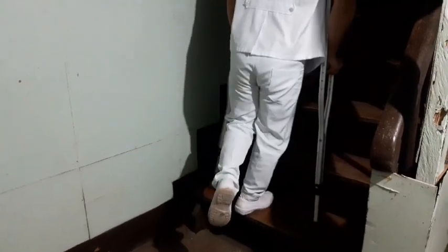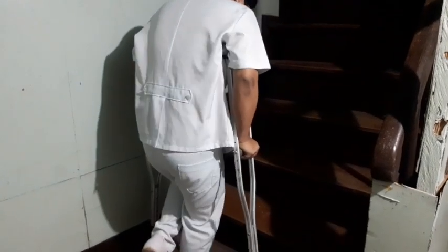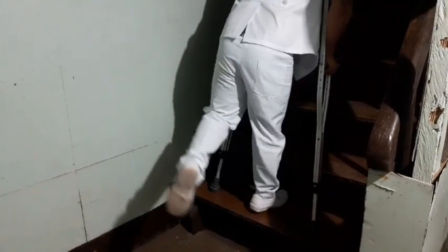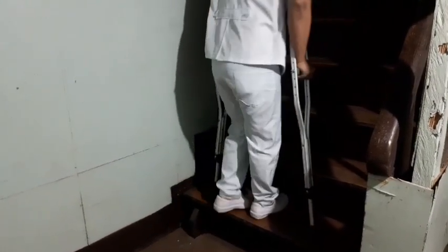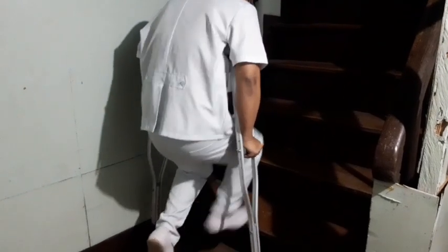For walking upstairs, stand behind the client and slightly to the affected side. Place both crutches on the same level as the feet. Now advance the unaffected leg to the next step while bearing down on the crutch handles. Pull the affected leg and crutches up to the step while bearing weight on the stronger leg.